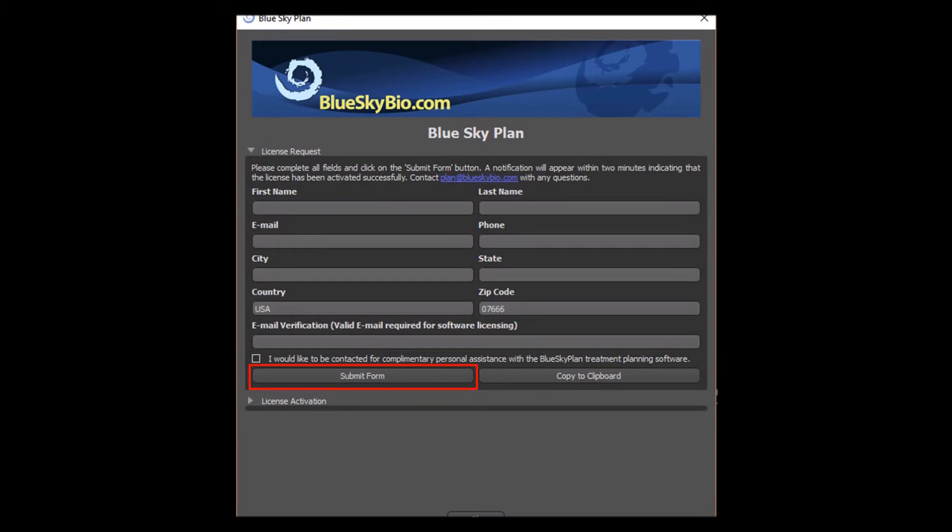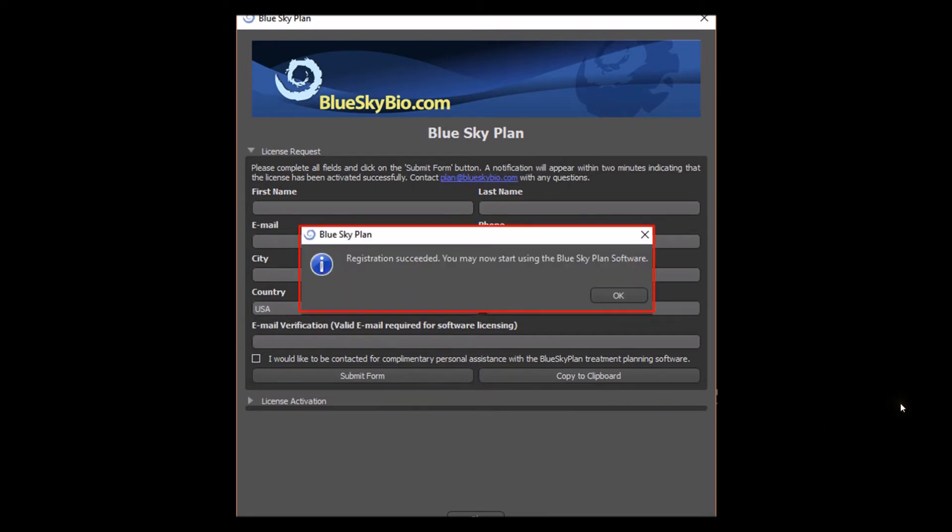After downloading and installing the software, complete the registration form and press submit form. Within a few seconds of pressing the submit button, a notification will appear confirming that the software has been registered successfully.